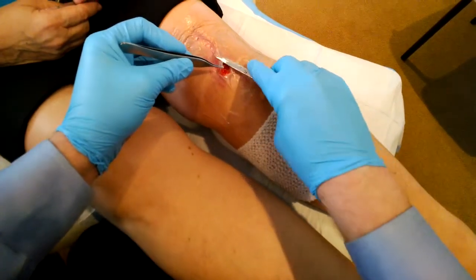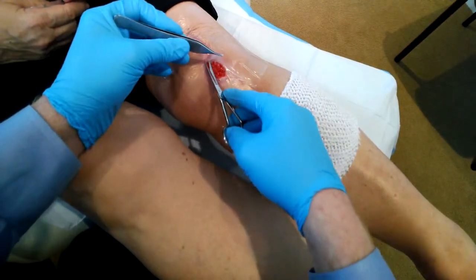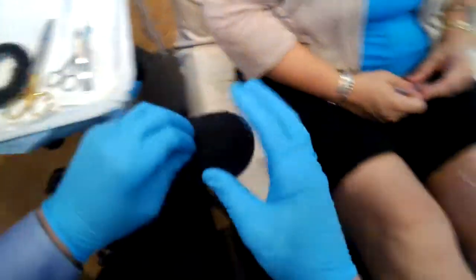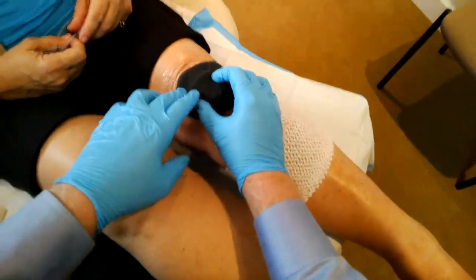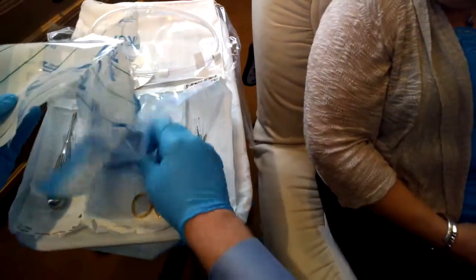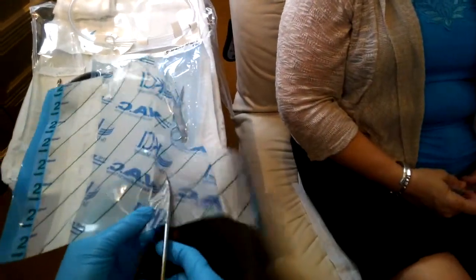There's definitely some arts and crafts skills involved with this procedure. So there's our window into the wound. Now we're going to take our sponge — this is the key to the procedure. I'm going to place the sponge right here, and we'll get the sticky drape back here. Next we're going to take our sticky drape and apply it over the sponge.